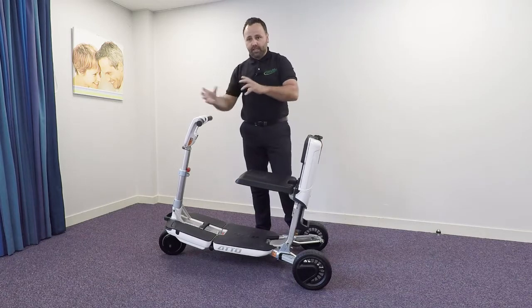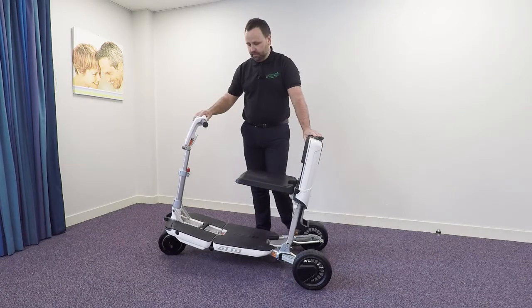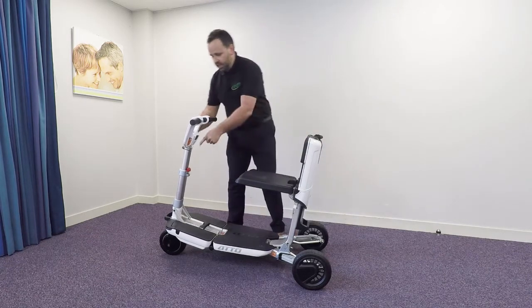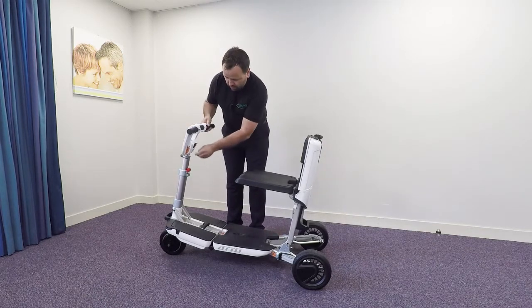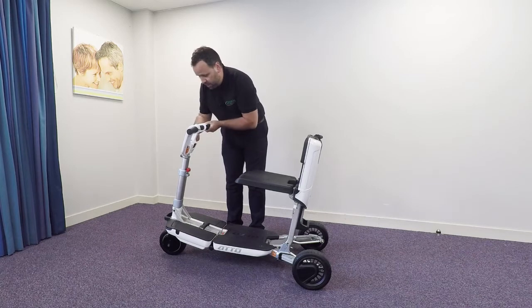With this scooter there's no bits to add or take on for assembly. The tiller's height and angle adjustable, making it easier to find the best comfortable position for your driving.